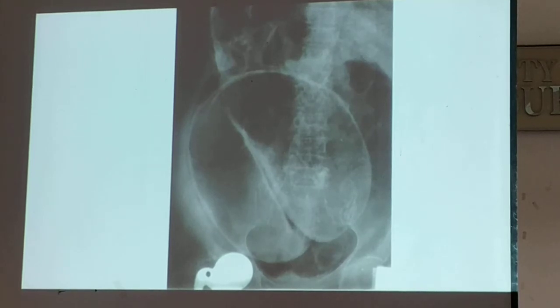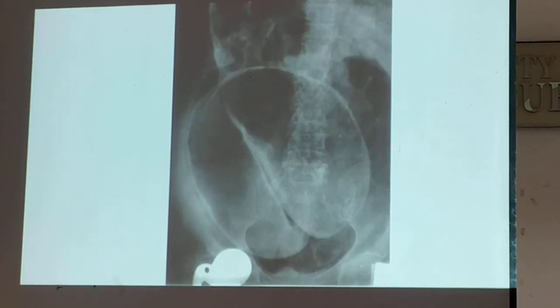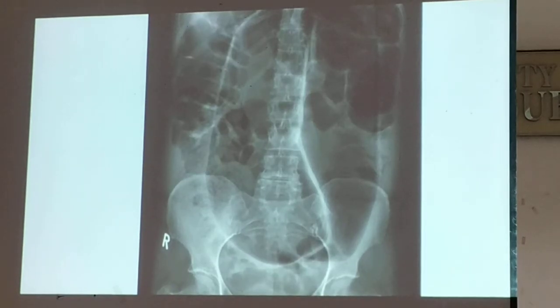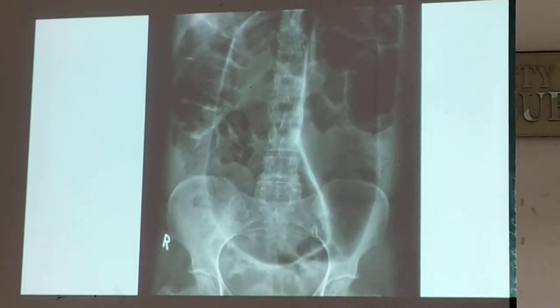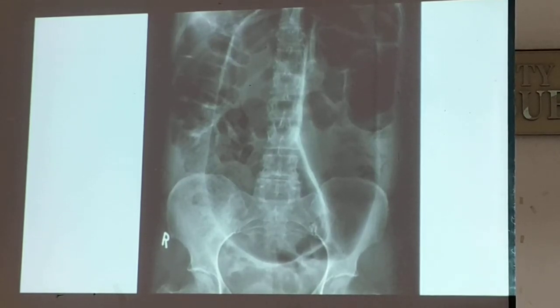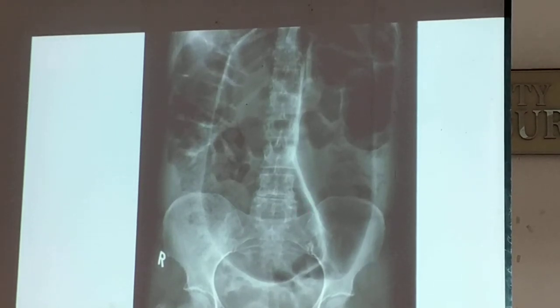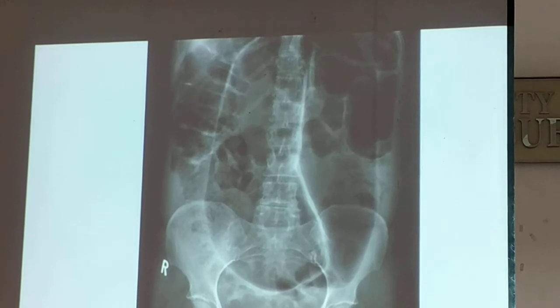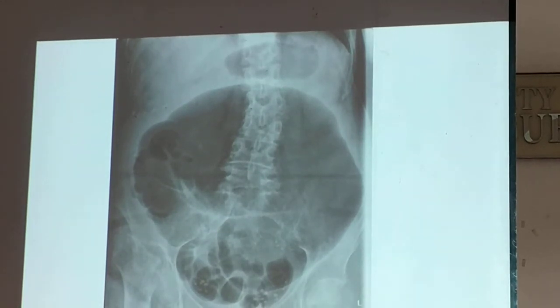So how many signs are there now — there's the football sign and the coffee bean sign. This is another picture of the coffee bean, and this one is more typical. Is this small bowel or large bowel? Large — because if it were small bowel, it would have already ruptured. The diameter is almost one half of your film.